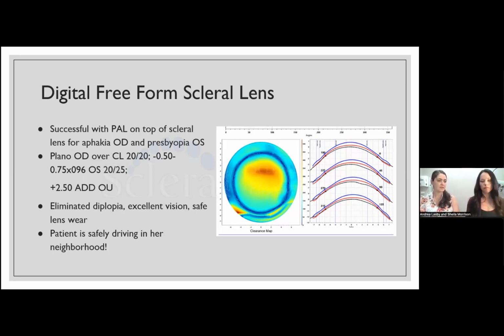Now, Dr. Morrison, you talked about endothelial cell count. Is there a minimum that you prefer to see for contact lens success? When we talk about if you get those endothelial cell counts, let's say from a partner ophthalmologist, or if you have that in your clinic. I used to be afraid a little bit, because there was an old cutoff of, make sure that it's got to be at least 1,000. And then I have been very comfortable with, I tried for around 800.